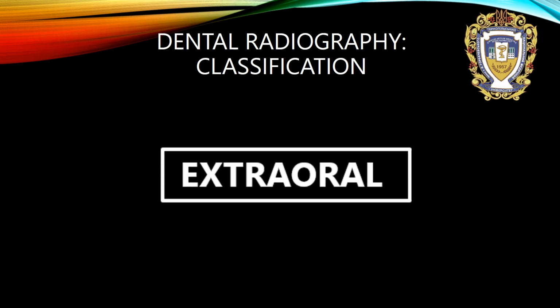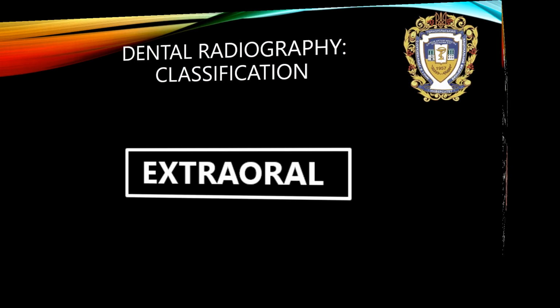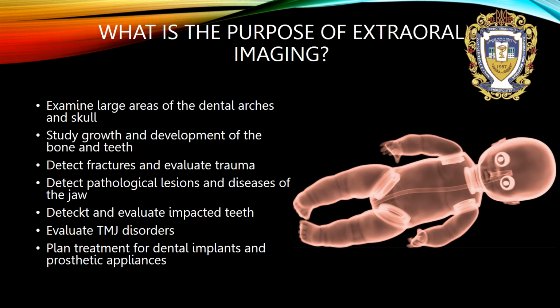And now about extraoral X-rays. What is the purpose of extraoral imaging? Examine large areas of the dental arches and skull. Study growth and development of the bone and teeth.